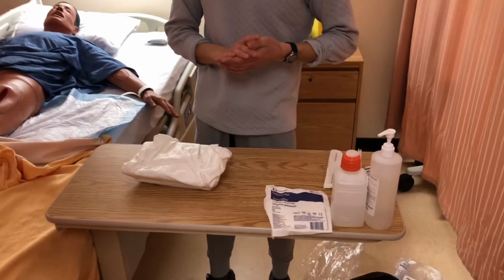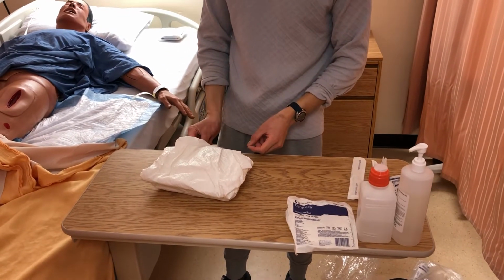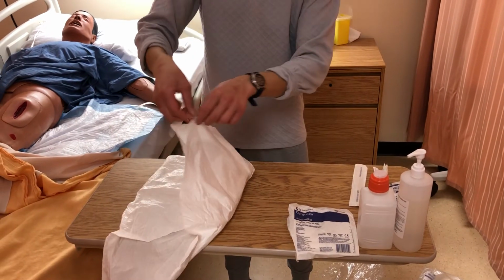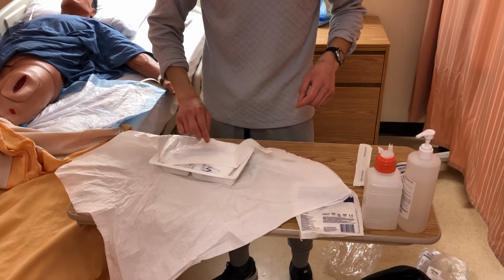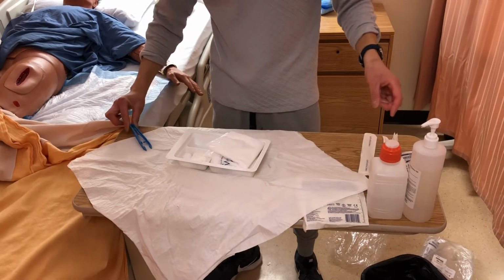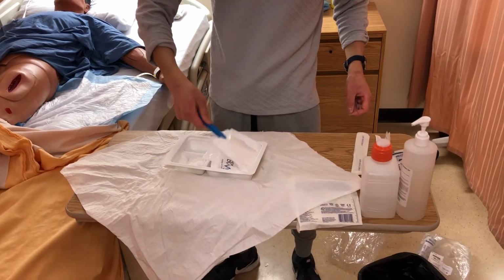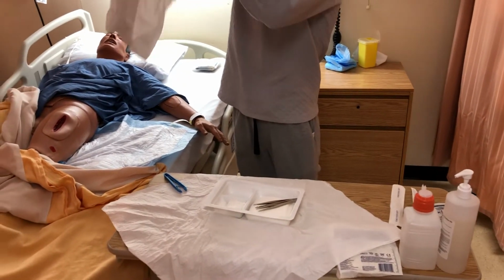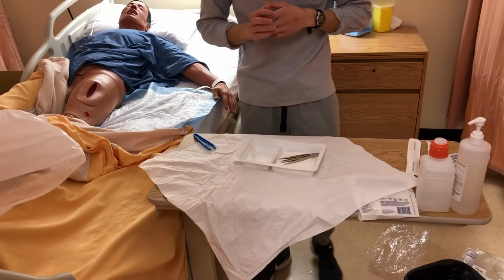So the first thing I'm going to do is I'm going to open it, touching only the 1-inch border. I'm going to take out my blue pliers. And I'm going to take out my garbage bag. I'm going to place my garbage bag at the bottom of the patient's legs, and now I will get my silver pliers.